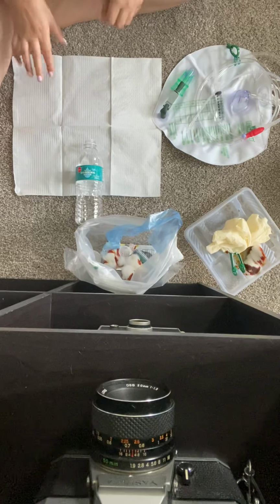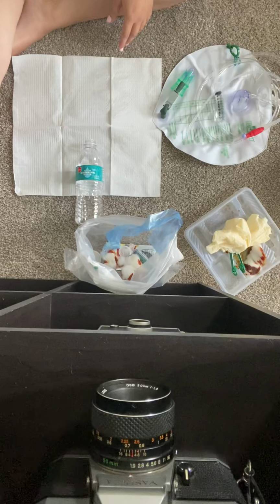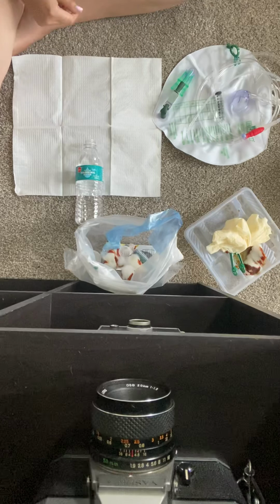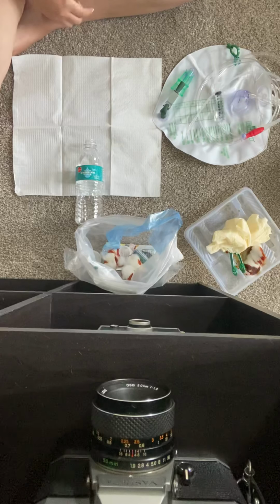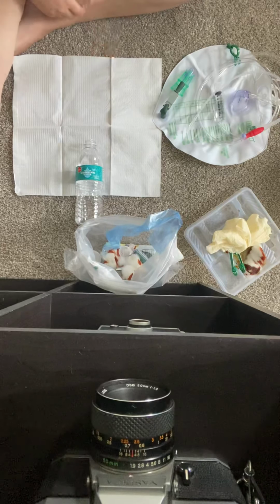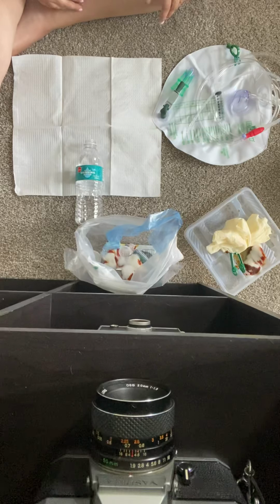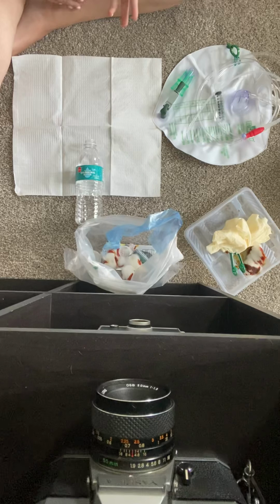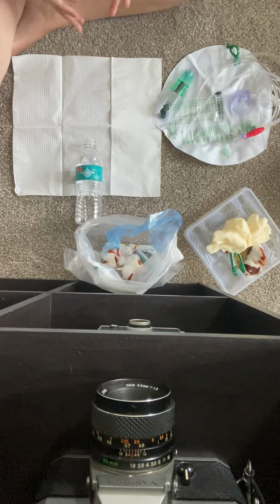And then usually when I take my patients' Foleys out, I say, I'm going to take this out, and I'm going to give you 6 hours to void. If you don't void within 6 hours, then we will do a bladder scan. If the bladder scan shows over X amount, whatever your hospital policy is, then we'll go ahead and do a straight cath. I like to warn them, because you should be letting them know what's coming, so they're not like, what do you mean I only have 6 hours to pee?